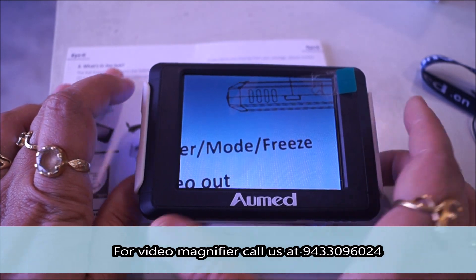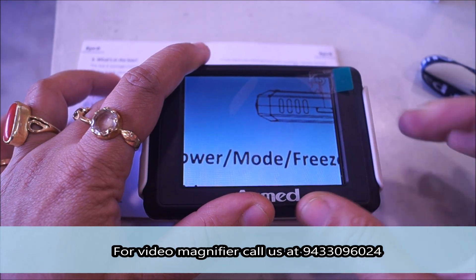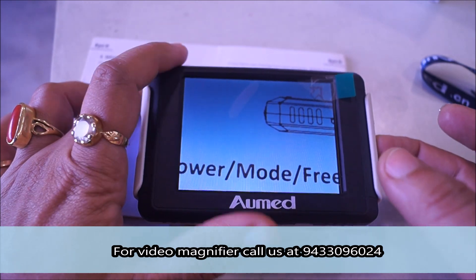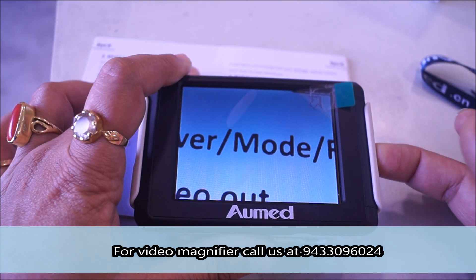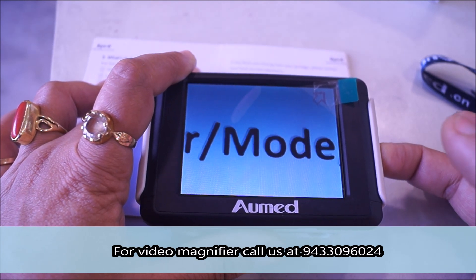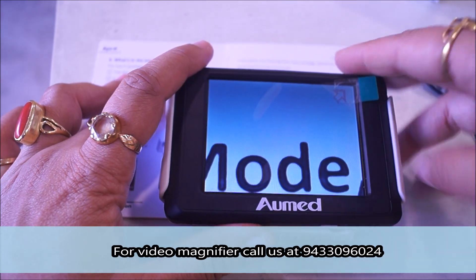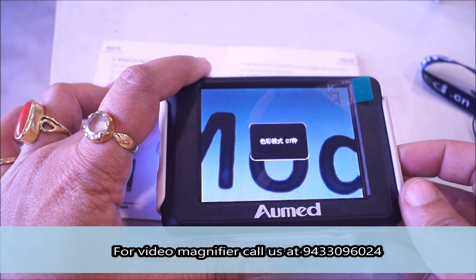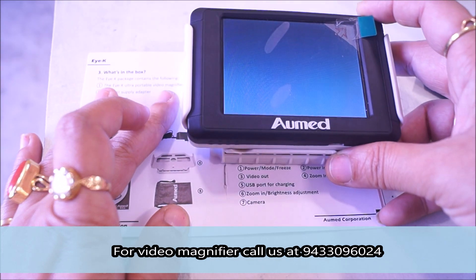Now let's look at the freeze mode. I will show you the magnification. If you keep pressing the right end switch, the magnification keeps on increasing. There is a maximum magnification you can achieve — so this is the text size compared to the maximum magnification level.